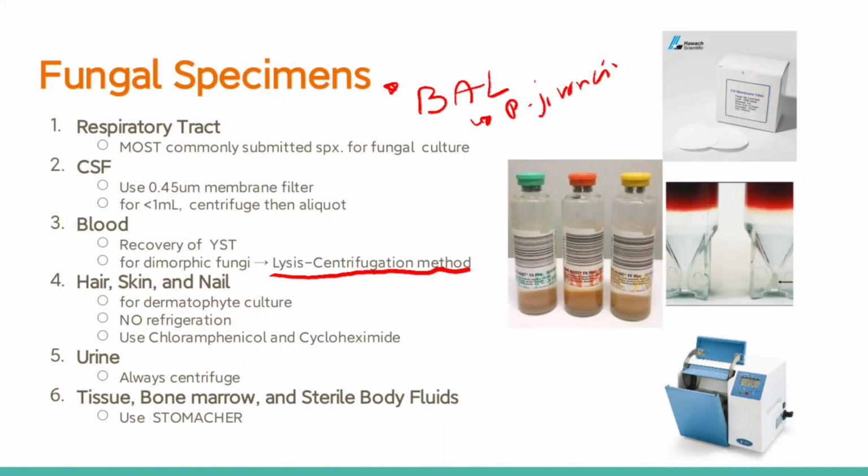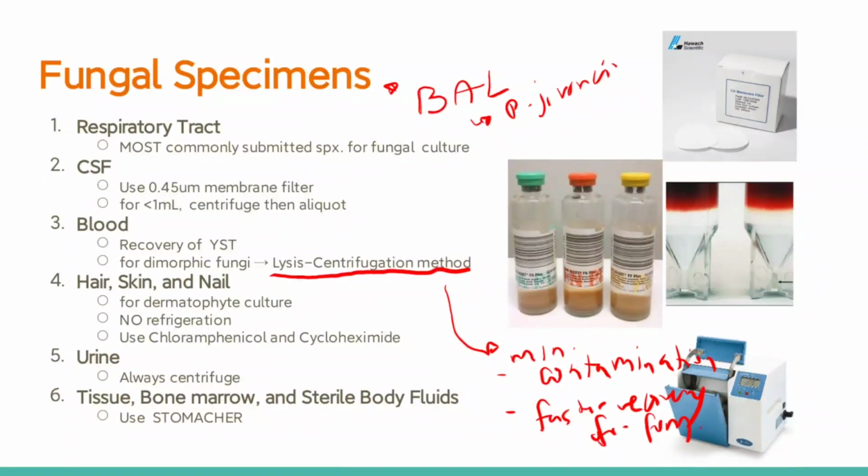So what is the purpose of this? The purpose of LCM or the lysis centrifugation method is to minimize contamination, and secondly, to have faster recovery for fungi. Okay? Let me repeat. The purpose of your lysis centrifugation method is to minimize contamination and also to have a faster recovery for fungi.